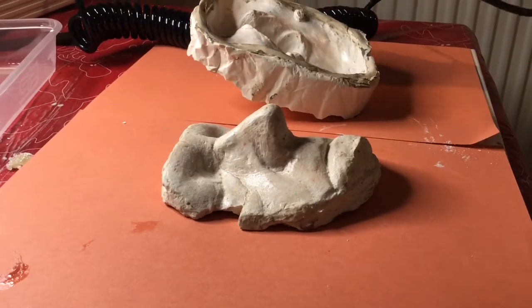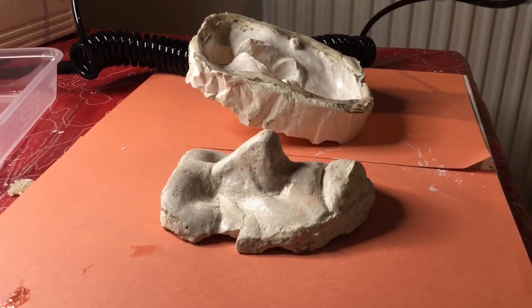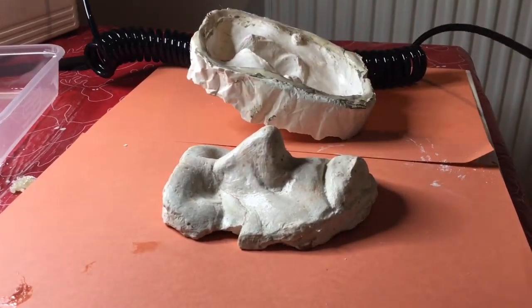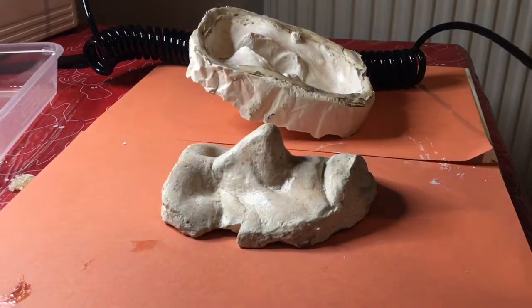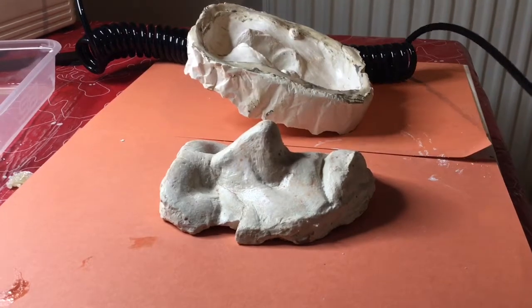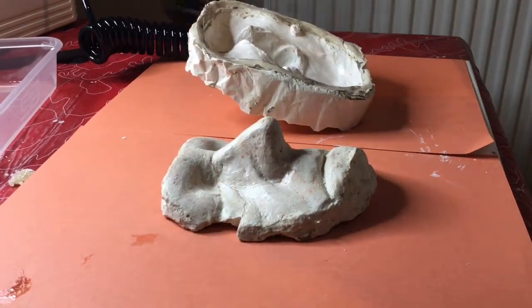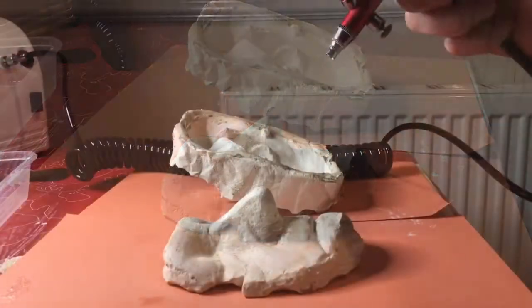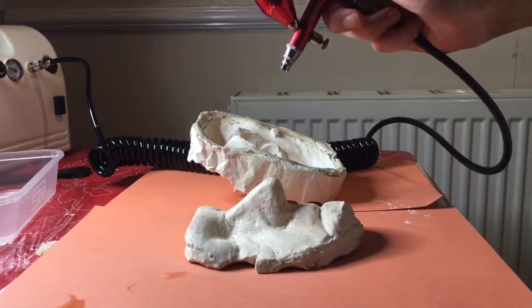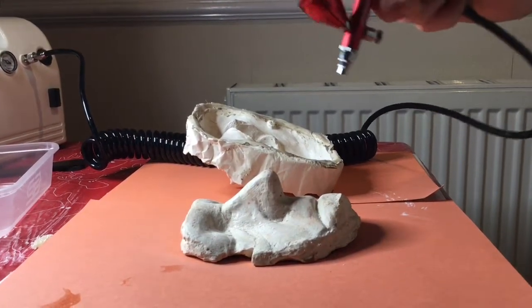It's also important when spraying the encapsulator through the airbrush to do so in a well-ventilated room whilst wearing a mask and goggles, and to make sure that anyone else in the room wears the correct PPE equipment as well. This is because it's really important that nobody inhales the fumes from the acetone because in small quantities it can irritate your nose, throat, lungs and eyes, which can feel very uncomfortable. Moreover, the reason that safety precautions are put in place when using acetone is because if larger quantities are consumed, it can cause headache, dizziness, nausea and vomiting, which would obviously cause serious harm to health and would be a huge health and safety breach.